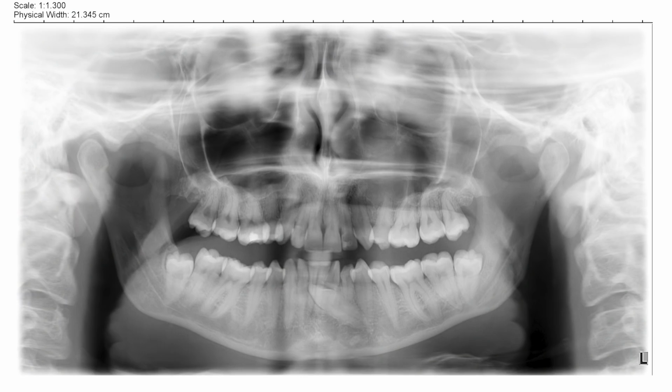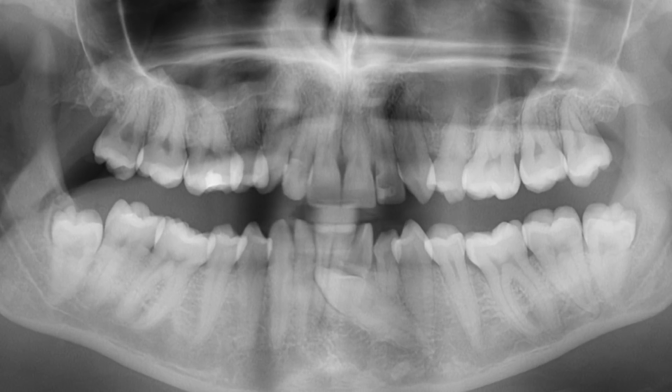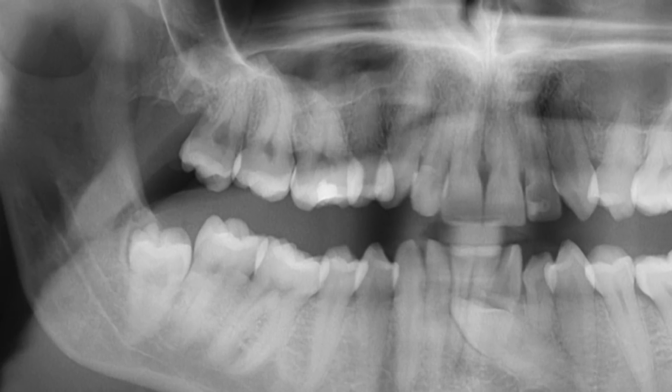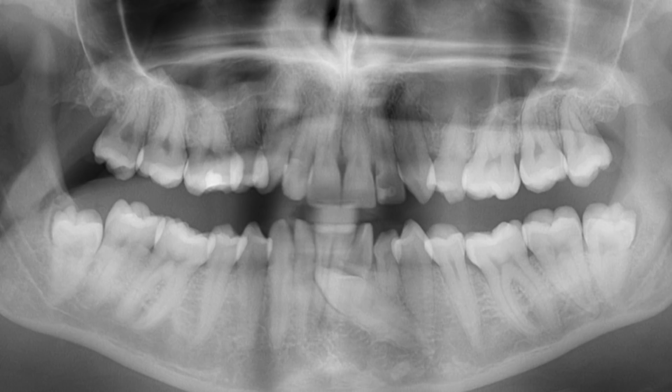You may notice straight away there's something a little bit odd about it. And you'd be right. So you can see generally, before I get into that, my top row of teeth there, they look okay. They're a bit squished, admittedly. There is some work there on what looks like a premolar, that tiny little filling I had. It was really a tiny little filling. I think I had a pit or something and it got filled, so that's okay. Apart from that, I haven't really had any work done, which I actually am quite proud of, because my diet used to be terrible and I used to drink Coca-Cola all the time.